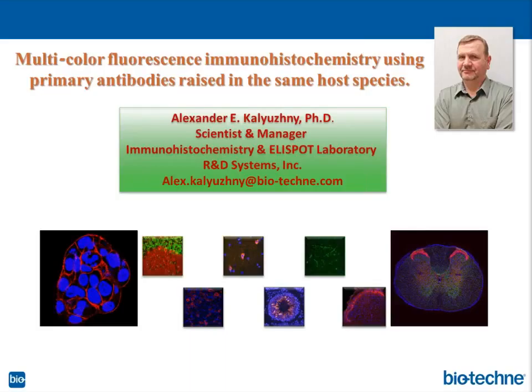There are several treatment techniques to quench endogenous autofluorescence. None of them is going to quench autofluorescence completely, but it helps. And it depends on the tissue you use. It may work better with one technique than with another in a given tissue. And please do a Google search.